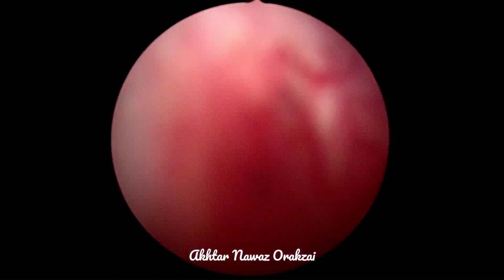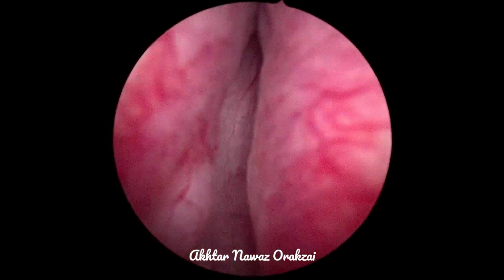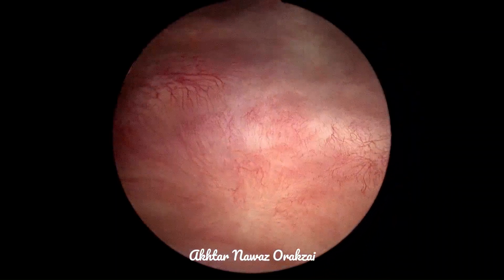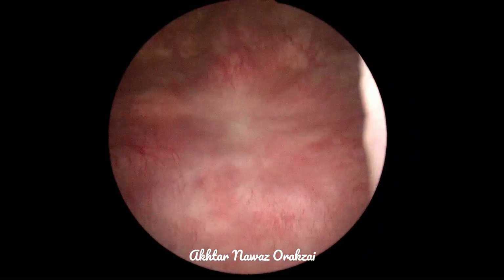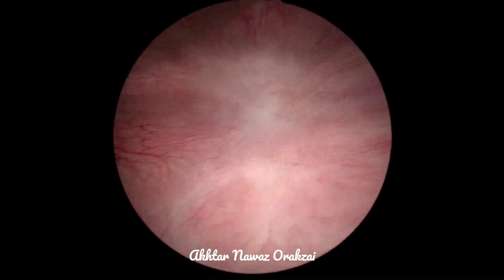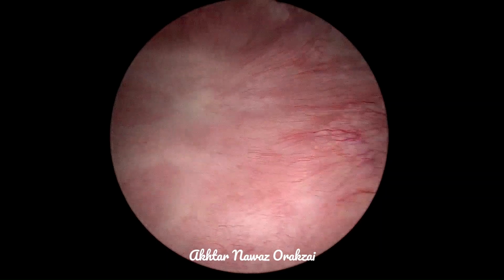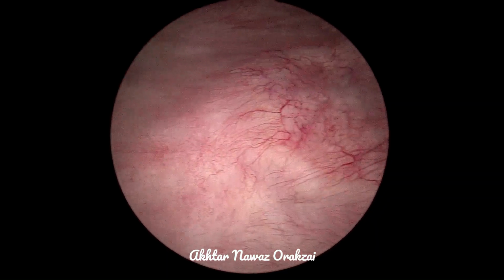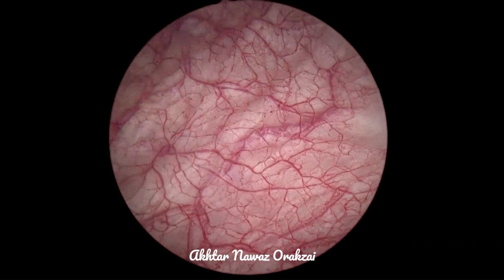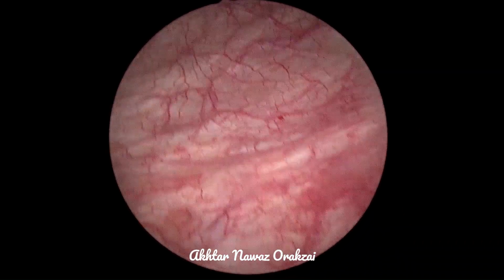This is a case of a bladder tumor, transitional cell carcinoma, which was diagnosed as a high-grade TA lesion. This is the right orifice. This is the left orifice, and this white is the area of previous resection. And so we are performing a Check Cystoscopy here.